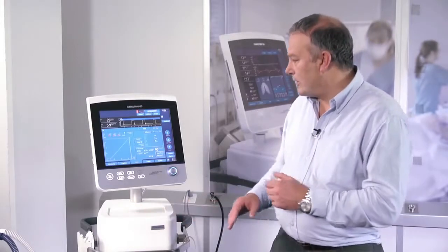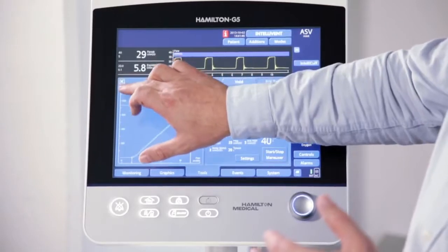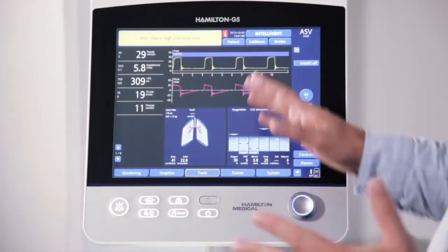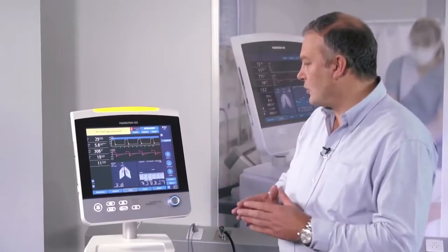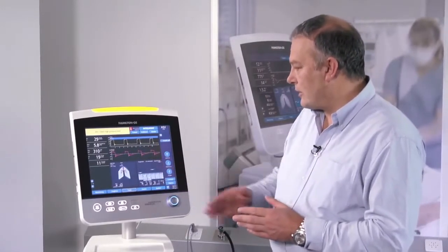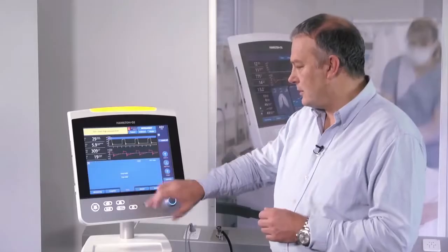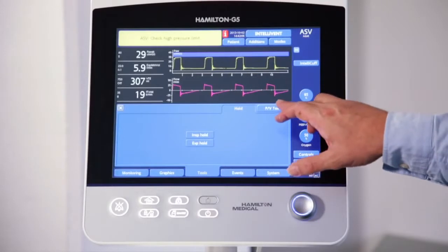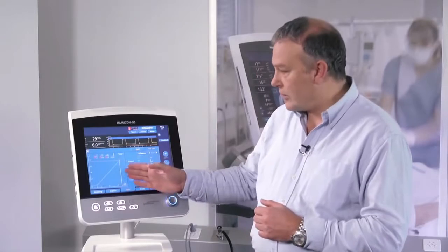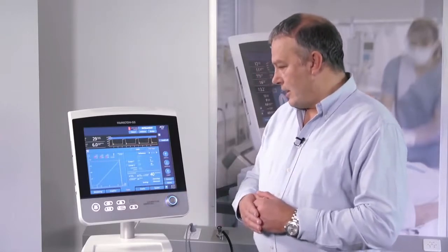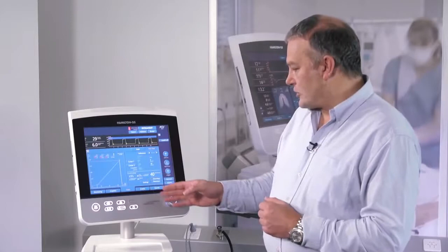The PV tool is essentially an automated super syringe that allows inflation and deflation curves to be created on the ventilator. To create it, I'll come back to the main screen. This is the ventilator working on an artificial lung and you can see the various parameters there. To get into the screen we push the tools button which opens up a menu and we select the PV tool. The PV tool has a screen where the data will be displayed along with the various settings.